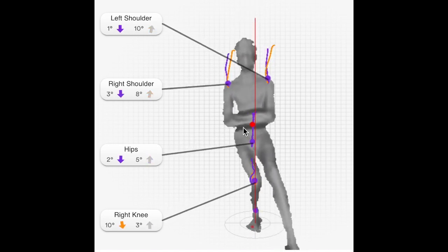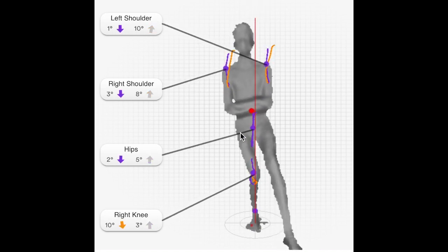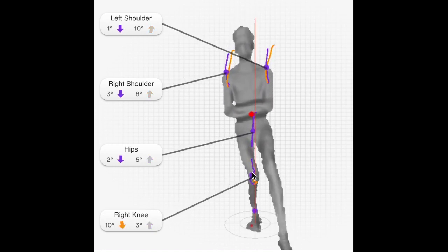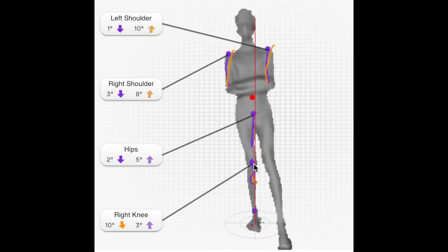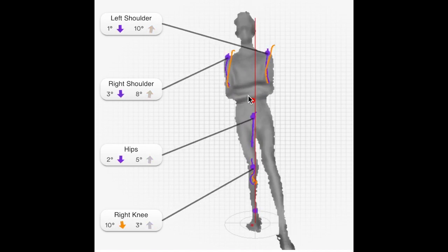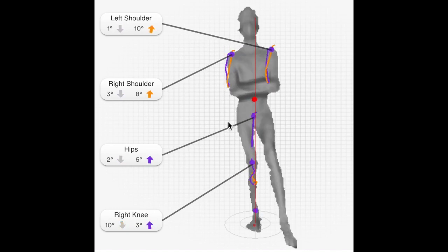Proper hip activation is necessary for this patient to restore his functional movement and address the underlying cause of his shoulder pain. With this baseline information from the scan, we'll be able to treat and correct compensations efficiently and rescan to show improvements in his movement. After his first session where we activated his hips using Redcord Neurac therapy, we found that his shoulder pain has already significantly reduced.